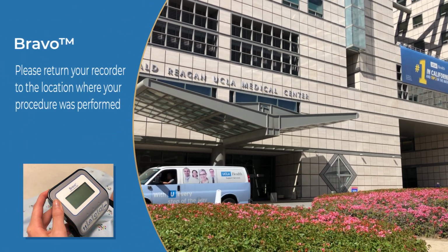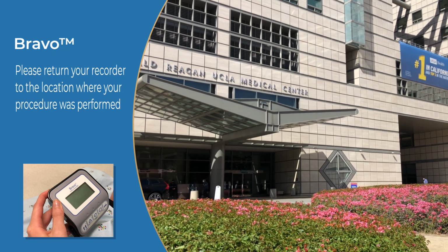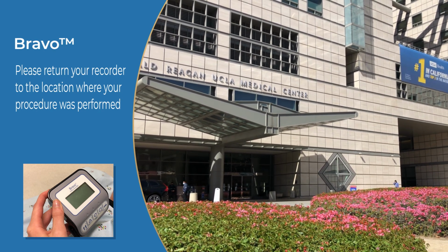When the Bravo study is done, the recorder turns off automatically. When your test is complete, please return your Bravo recorder and diary to the location where your procedure was performed.